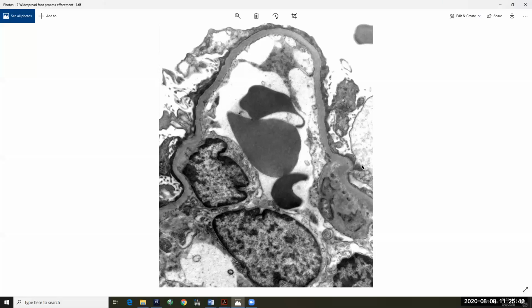But when you say affected, are you saying on light microscopy? The abnormality might be involving a few gloms on the light microscopy. But whether the disease is involving all the gloms or not depends on whether this is a primary FSGS or a secondary FSGS. And that is the segue of classifying, right? That is the point of classifying FSGS, because we want to know who is the driver of that podocytopathy, and is it involving all the gloms or only few of the gloms.